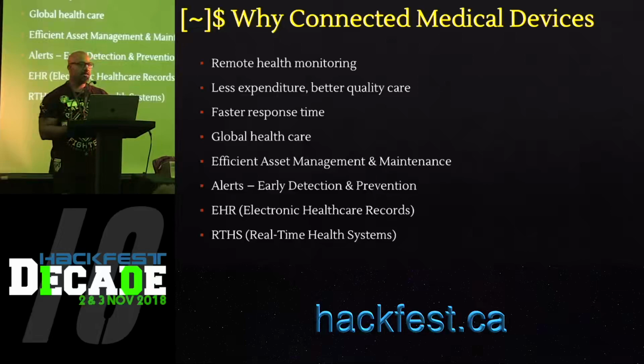And honestly, when I started looking at this device, I'm like, it looks like a small pen. In the best case scenario, I might just be able to capture some prescriptions that are stored on the device, but nothing more than that. But at this point of time, we were connected to the backend database as root, and we could access all the patient data from all the medical institutions these pens were deployed at, and not just our test pen.